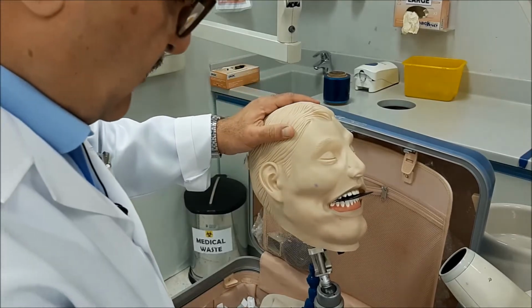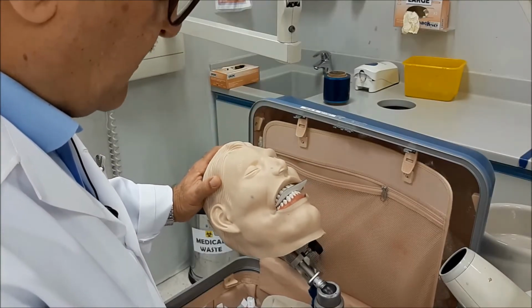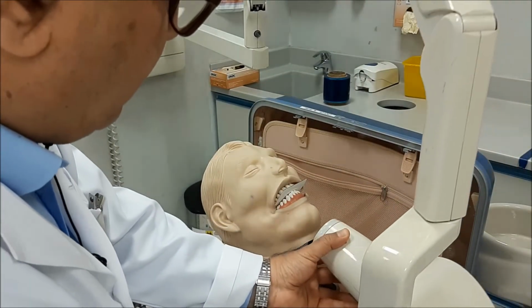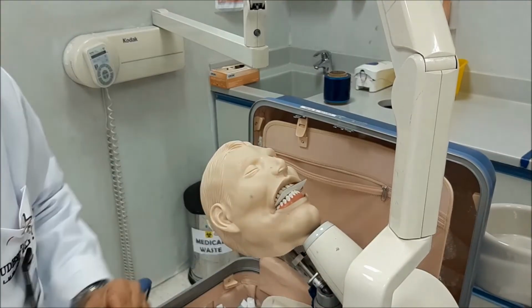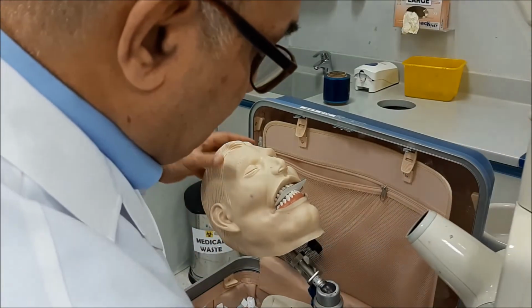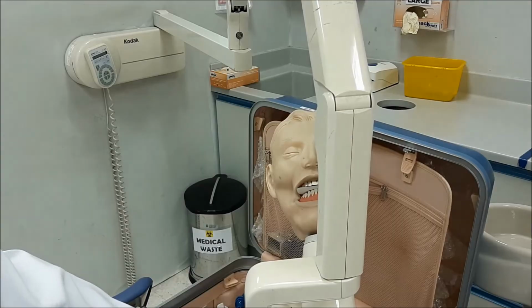In this technique, you will ask your patient to tilt the head backwards as much as the patient can tolerate, and then you are going to direct the beam in a way so that it will be perpendicular on the film. So the X-ray is going to be perpendicular on the film, and make sure that the beam is directed along the mid-sagittal plane, so that you will guarantee equal coverage of both sides.